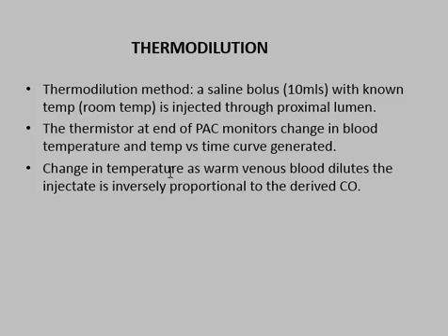And this change in temperature, as the warm venous blood in the pulmonary artery is diluted by the injectate that's cool, is inversely proportional to the derived cardiac output. Again, we'll have a look at the formula and you'll understand why.